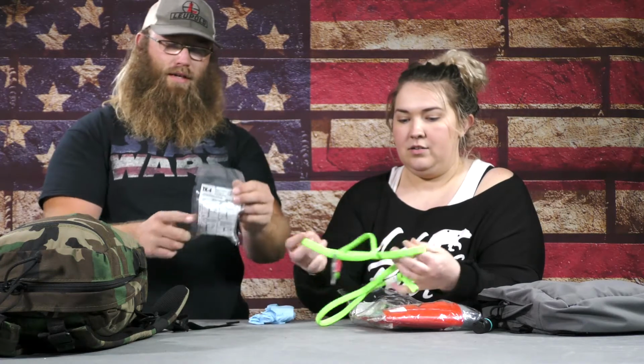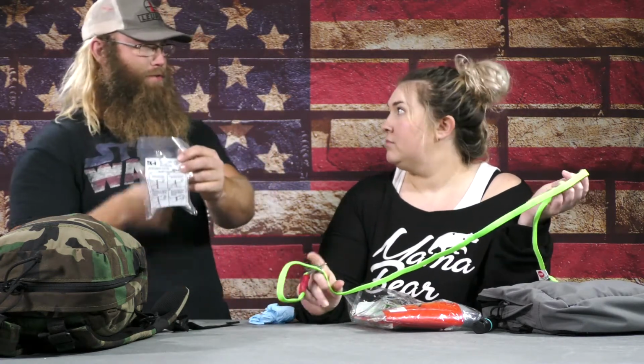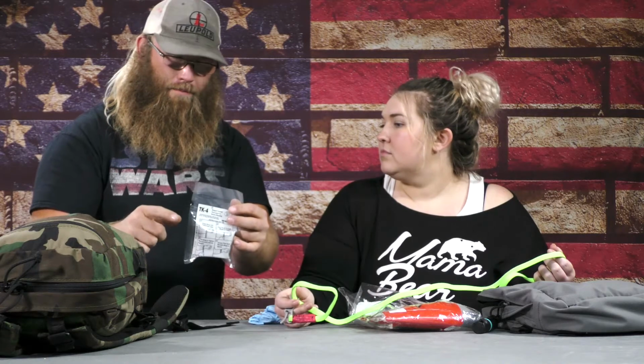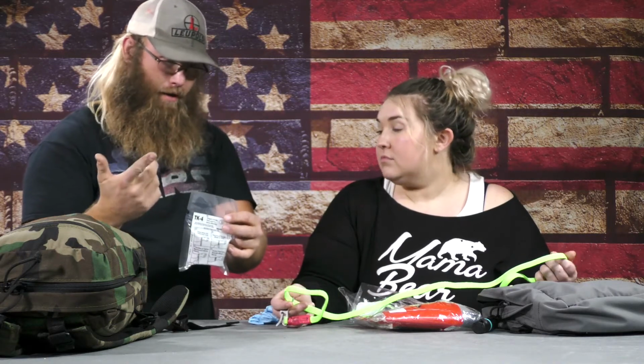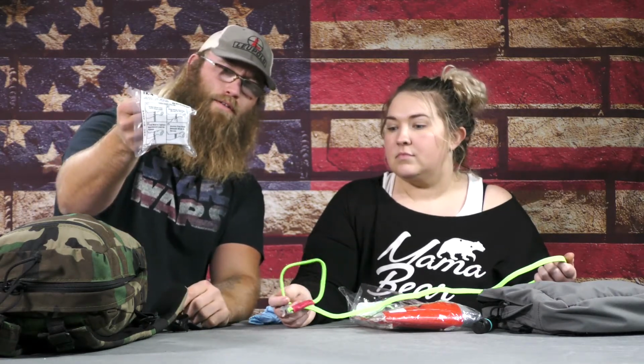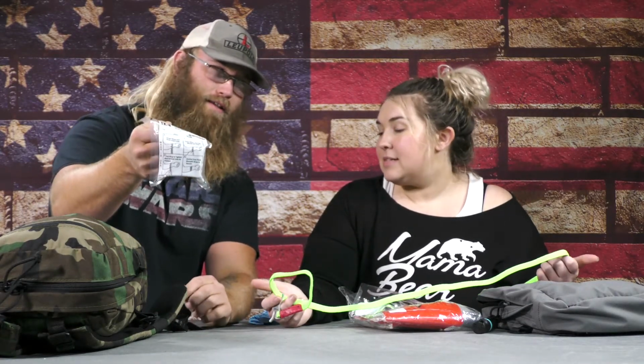It's this tourniquet right here, the TK4, and those were originally what the Marines had, right? I keep hearing about Marines used to have these when I watch medical videos. It's not the one you see all the time anymore, but they work good. I find that these ones are a little bit easier to apply, but it's still good to have that. And it fits anywhere. It's tiny.